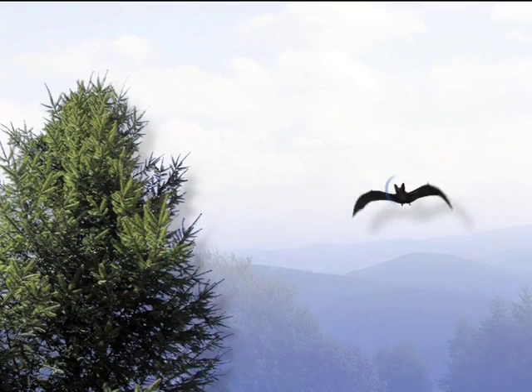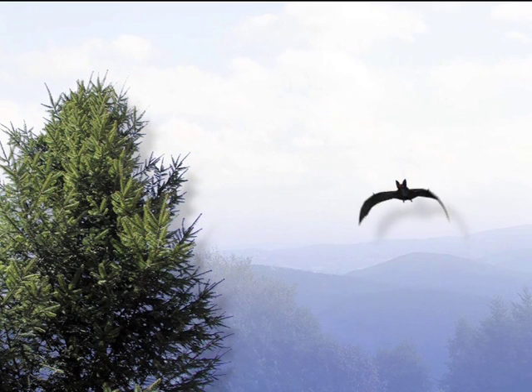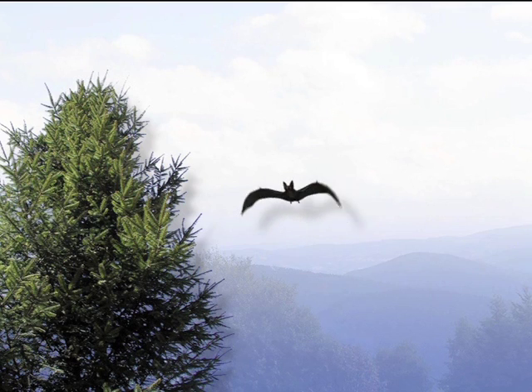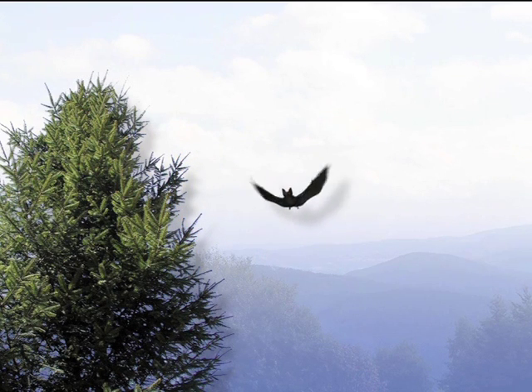Bats emit ultrasounds when they fly. They sense the echoes — that is to say, the ultrasounds that bounce off of objects in their way or off of insects to be eaten. It's the same principle for observing certain internal organs.